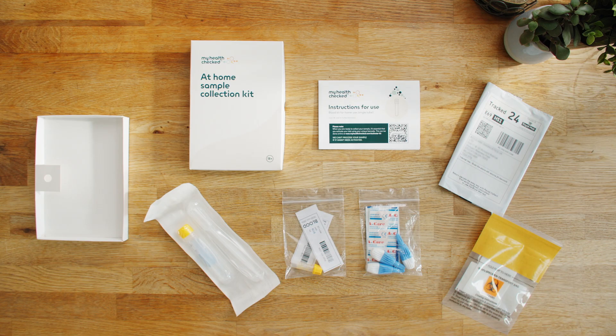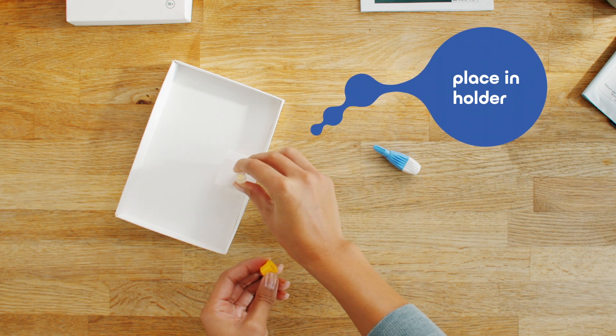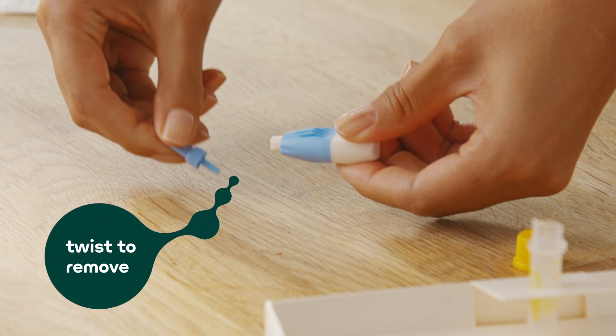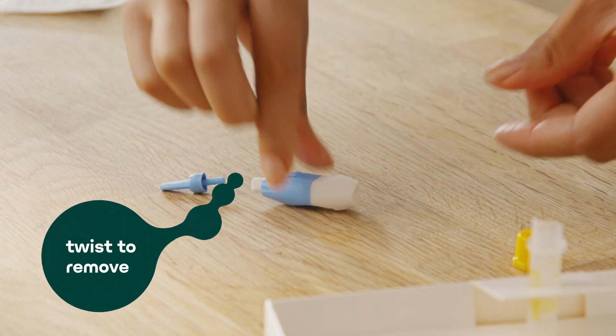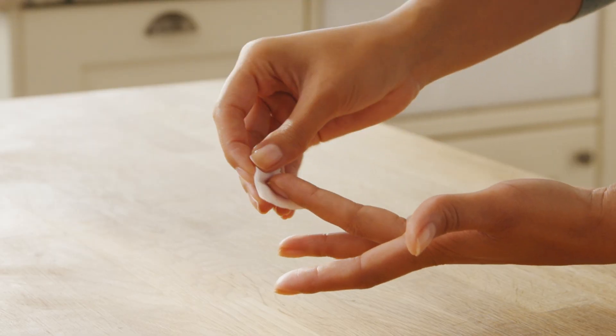You are now ready to begin your sample collection. Remove the cap and place the tube into the circular cutout provided. Twist the lid of one of the safety lancets to remove it. Using the alcohol wipe, clean the tip of your chosen finger and allow it to dry.